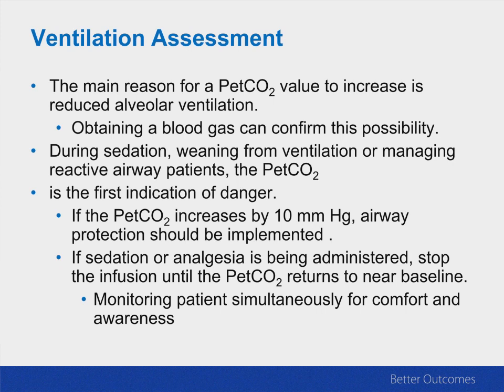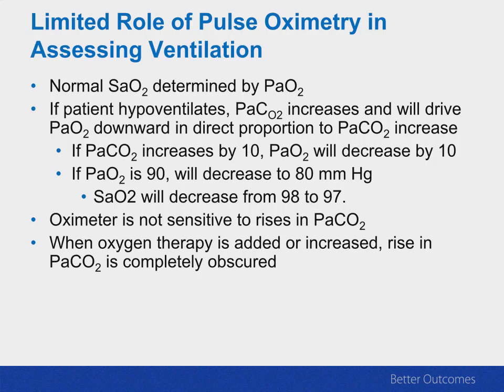Now, first of all, that's really all you need to know. I'm going to go into some details regarding capnography and its use. Bottom line is, if we see a capnogram go up, and certainly go up by 10 millimeters or more, you want to be concerned. You can always get a blood gas to make sure that the capnography level is increasing along with the arterial level. And certainly the pH would tell us how much danger you're in. But the capnography level by itself, if you're monitoring it, that alone is a warning sign.